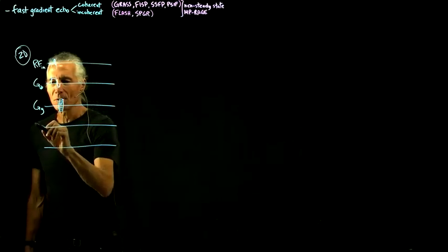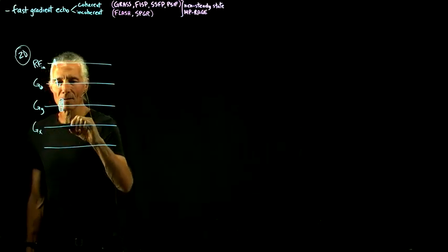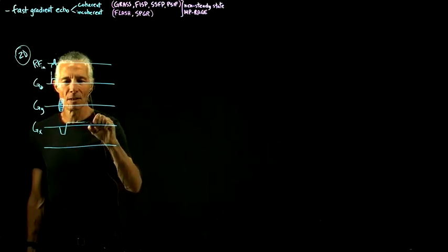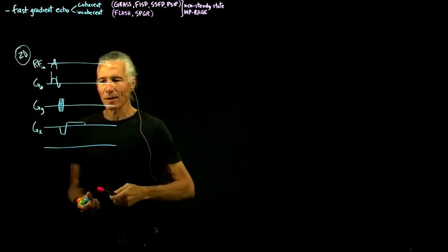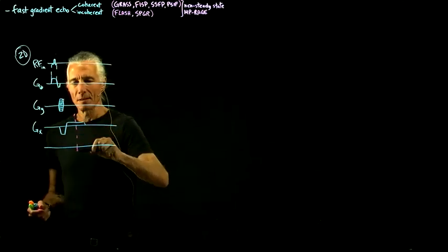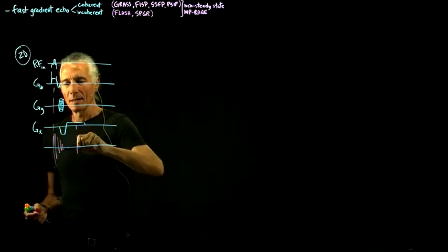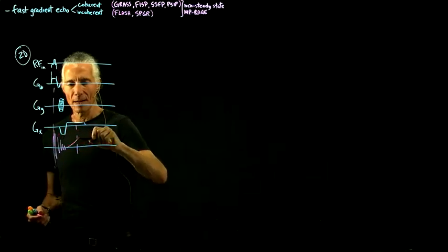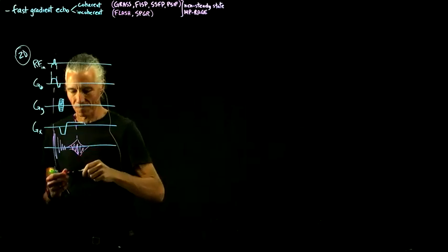And then we do a readout. First we go to the left side of k-space, and then we go across k-space. And in the middle, we get a gradient echo. When we do this RF pulse, there's a big FID, which we ignore. And then here's the actual thing we're recording. So that's our gradient echo.